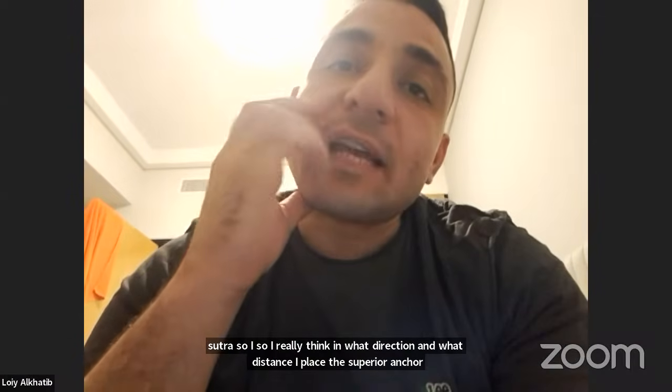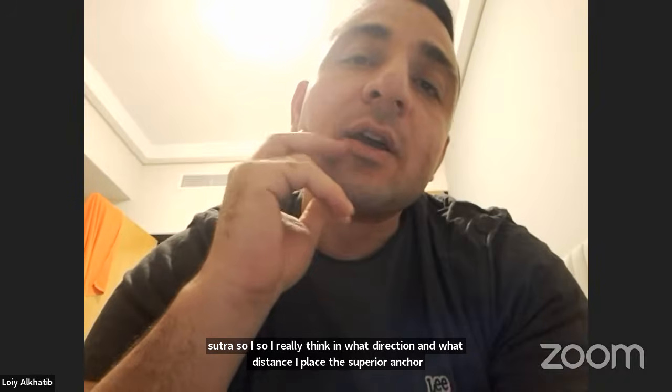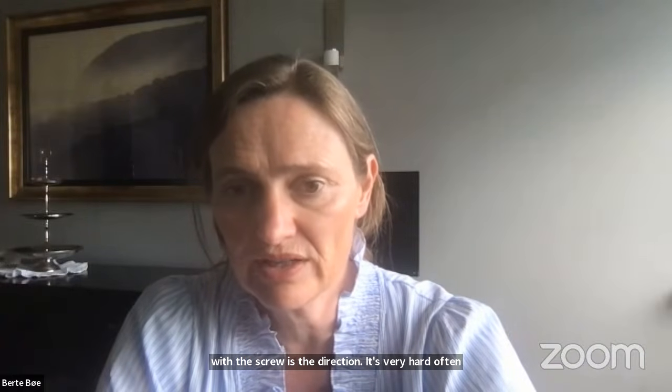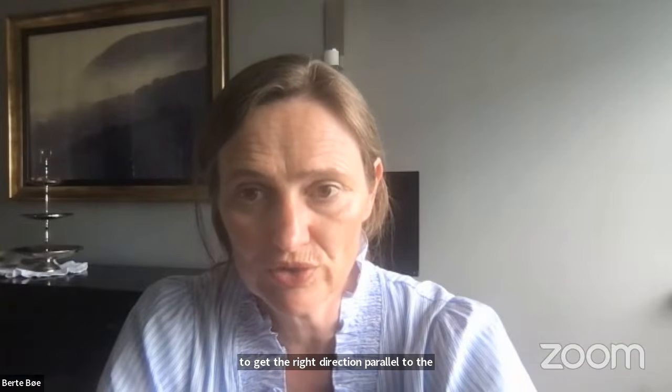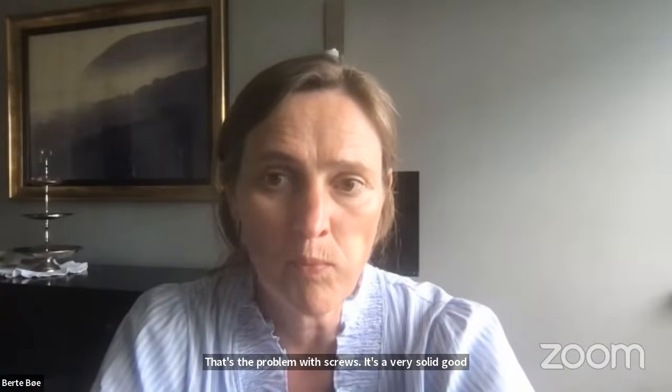I agree. So last comment, do you believe these guys who were fixed with this technique might have a faster recovery compared to guys who were fixed with the screws or other devices? Screw is a very solid and good fixation. The problem with the screw is the direction. It's very hard often to get the right direction parallel to the joint. That's the problem with screws. It's a very solid, good fixation if you're able to get the right direction.